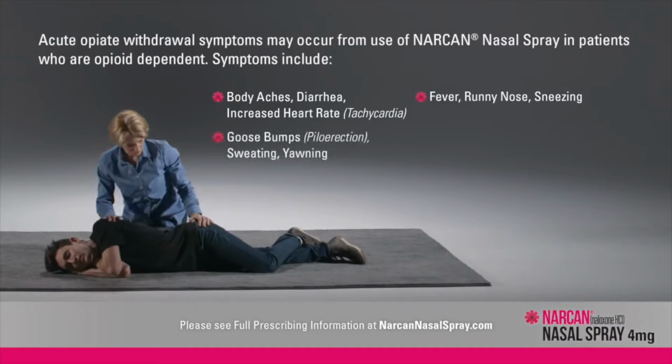When the emergency is over, put the NARCAN nasal spray back in its box and throw it away in a place that is away from the reach of children. In addition to watching this video, please read the quick start guide that comes with NARCAN nasal spray before using it. Talk to a healthcare professional if you have any questions about how to administer NARCAN nasal spray. Please read the indications and important safety information that follows.